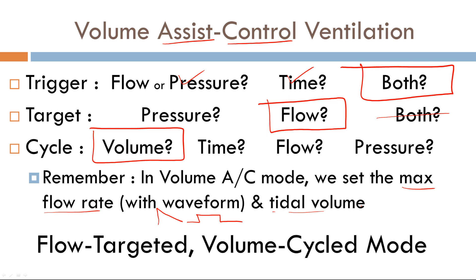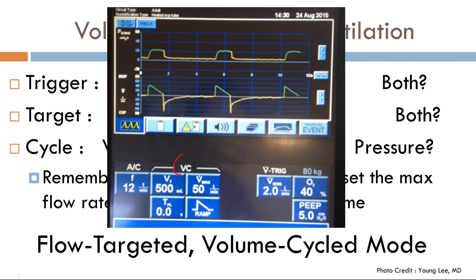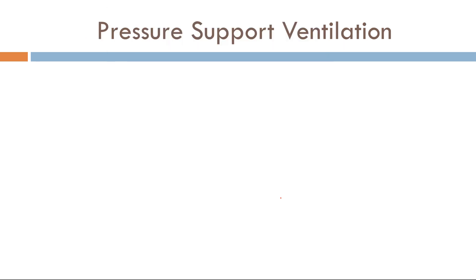Volume assist-control ventilation is a flow-targeted, volume-cycled mode. Looking at the waveform: the trigger variable for assisted breaths is a flow of 2 L/min; the backup controlled breaths use a rate of 12 breaths per minute (5-second time interval). The target variable is a maximum flow of 50 L/min plus the set waveform. The cycle variable is 500 cc tidal volume, and the baseline variable is PEEP of 5.